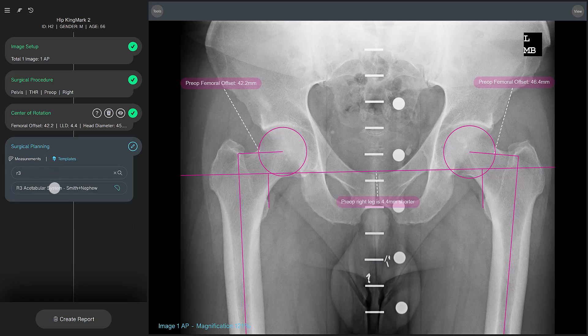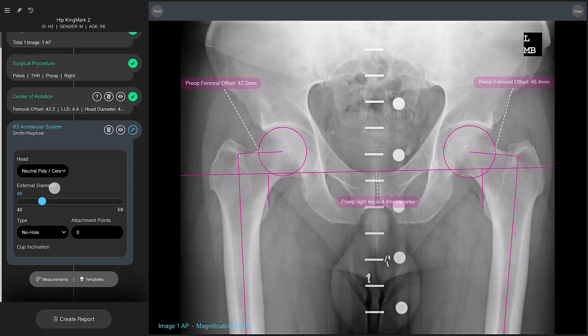Choose your desired template from the list by selecting it to have it automatically placed on the image. TraumaCAD NEO places the cup on the image using the size that was previously selected for the center of rotation measurement tool. At this point, you can perform minor corrections and adjustments to both the implant or the measurement tool.